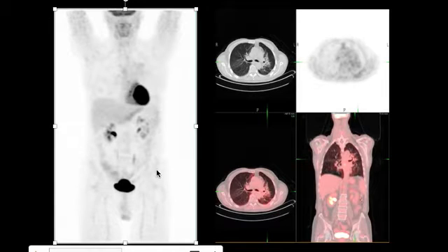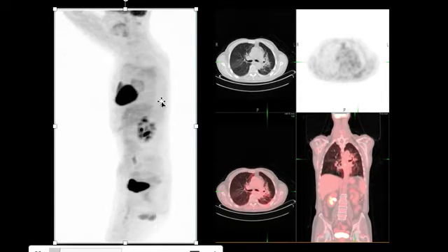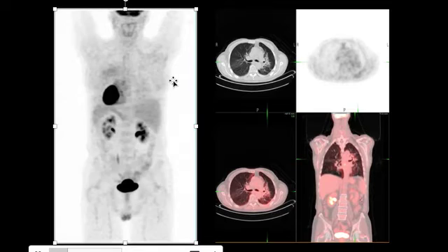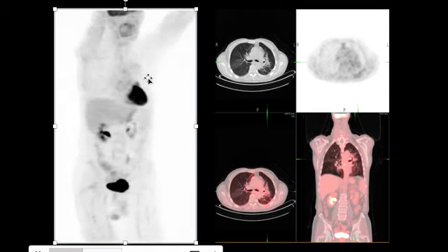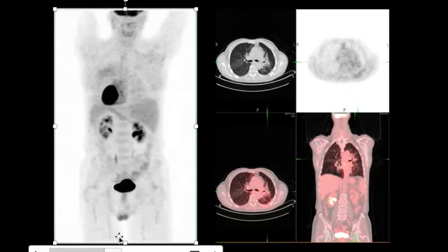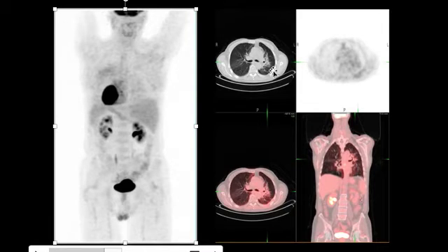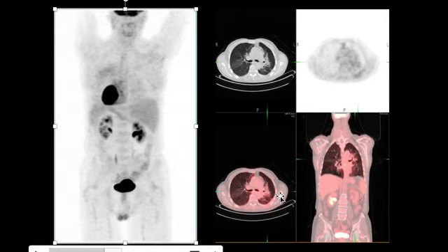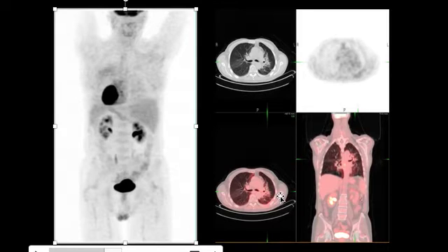Here is a rotating image. This rotating image shows interval resolution of the hypermetabolism in the left lung, and on the transaxial image we see that the multifocal consolidation has also mostly resolved. There is no focus of increased uptake to suggest residual or recurrent lung cancer. So this was definitely radiation pneumonitis which resolved over a period of time, and there has been good response to therapy.